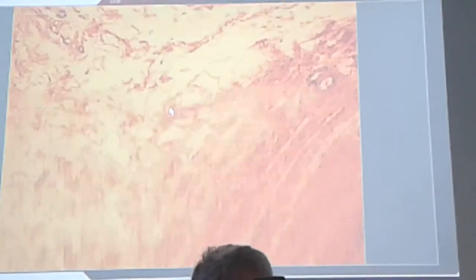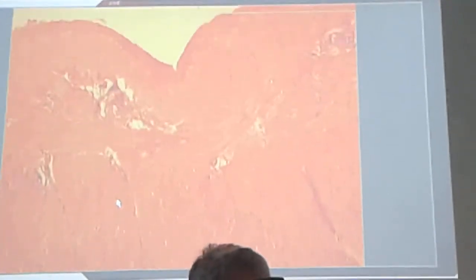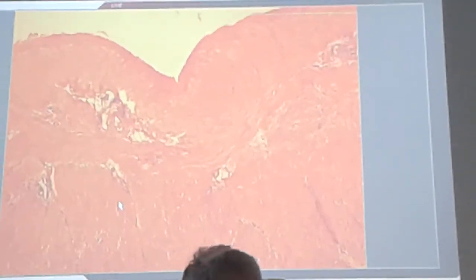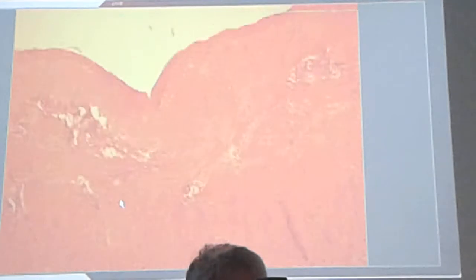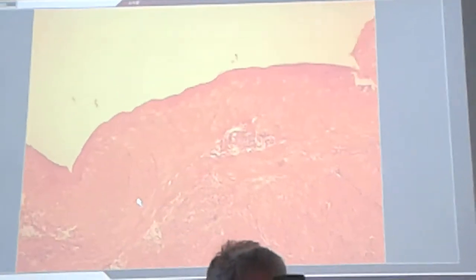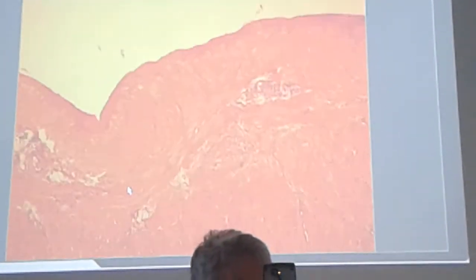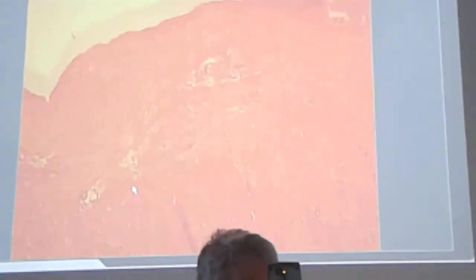But what about the next level? The tunica muscularis, muscularis externa. As you see, the smooth muscle is very, very thick. I will make a lower magnification. That's why there are many oblique and transverse orientations of muscle cells, but usually the outermost ones are longitudinal and the inner ones circular, and some oblique sections.